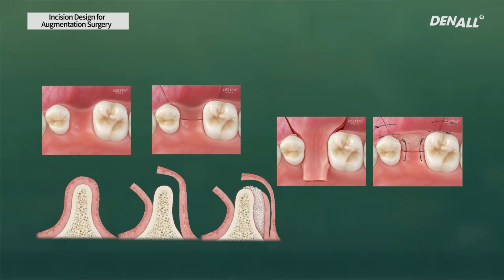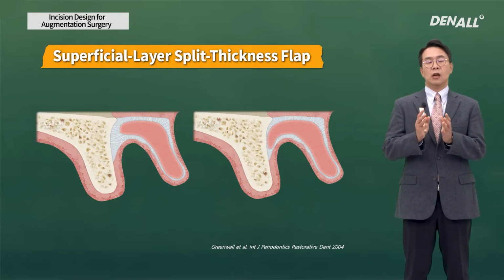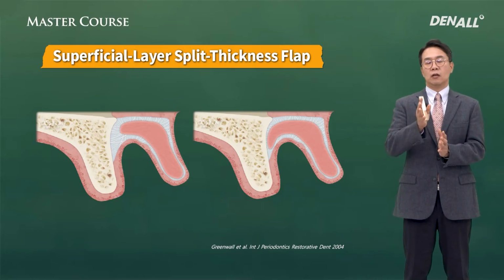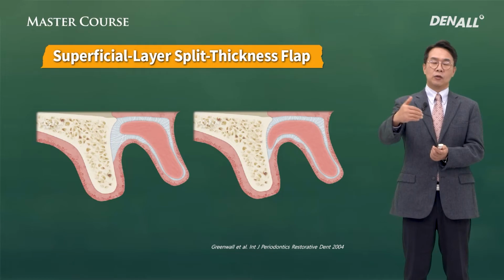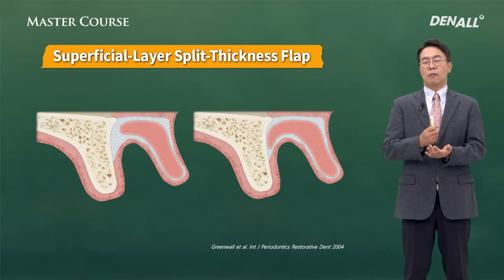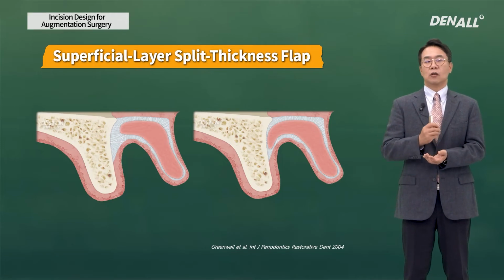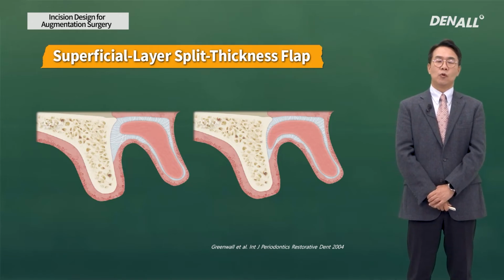In the illustrations, generally in upper or lower jaws, when vestibule is deep like in the left, muscle is inferior to that, so periosteal releasing incision can be made without a problem. But when vestibule is shallow, the muscles would be in the area that we want to dissect. So the muscles would be cut, which is not really effective compared to cutting the periosteum inside a flap to extend it, and a lot of bleeding can occur. And in many cases, patients complain of discomfort.